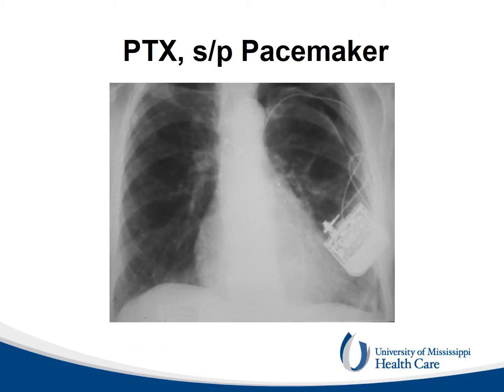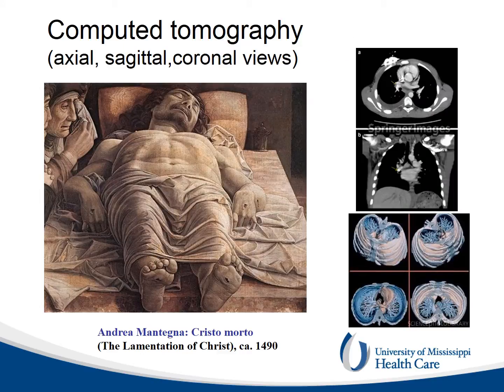This is an example of an iatrogenic pneumothorax created during the insertion of a needle in the left subclavian vein for pacemaker placement. The chest computerized tomography, commonly abbreviated CT, with and without contrast, is the most common imaging procedure used for the study of lung pathologies. The axial view is obtained cutting the body in slices, head to toes, and viewing them from the feet, like the observer of the body of Christ in this painting of the Italian Renaissance.